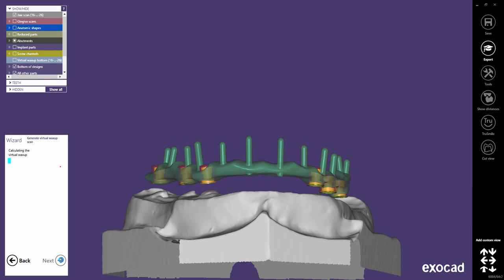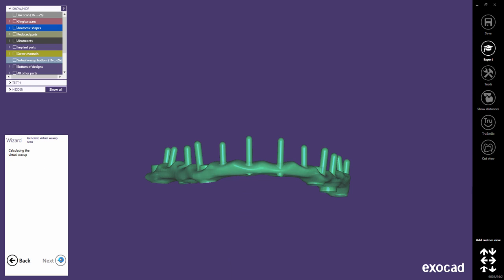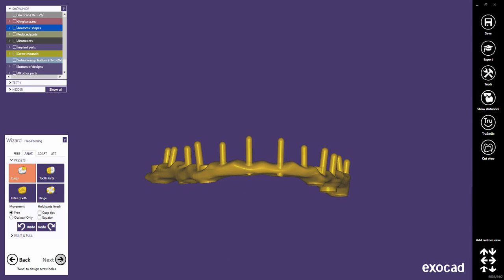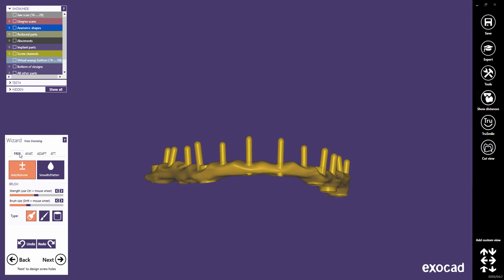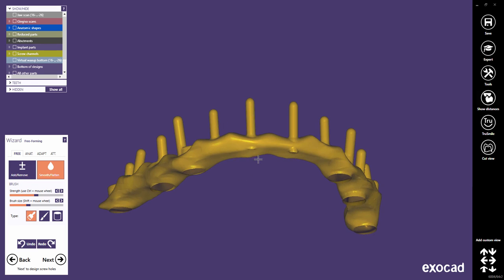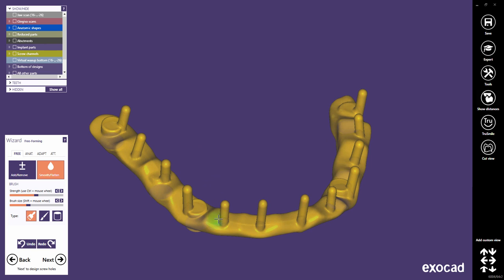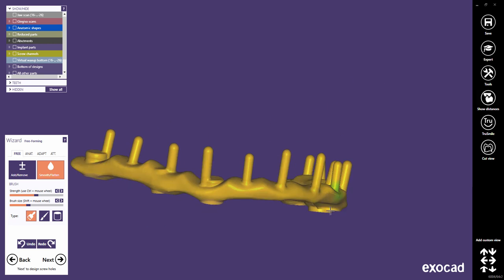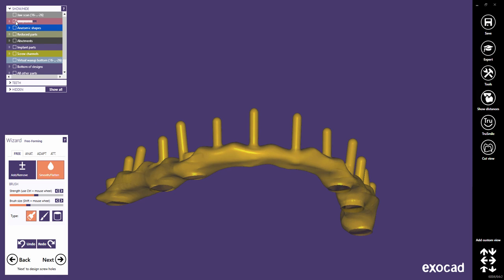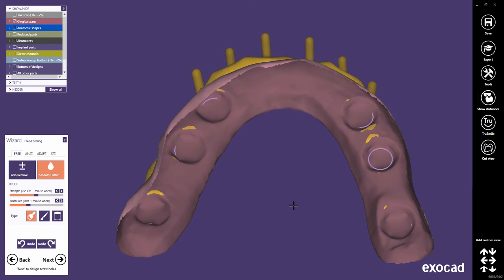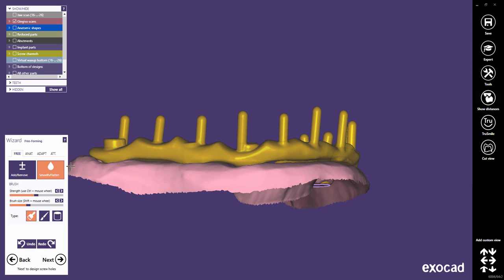This operation may take a while. Then click Next to freeform the whole merged restoration. As usual, you can add and remove material, smooth parts, or modify bigger areas. Furthermore, you can use the Adapt feature to create a uniform gap between restoration and gingiva.